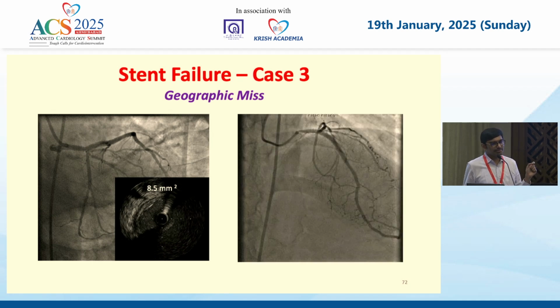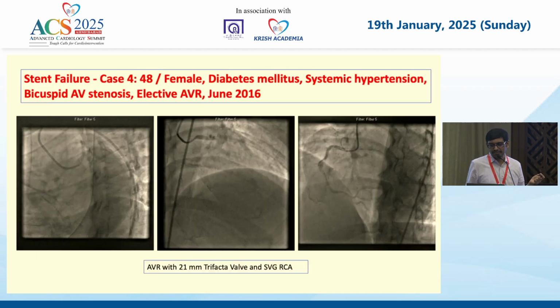2 months, you see that patient came back with a tight stenosis at the ostium. So the lesson learned in this patient is when your left main lumen is not very big in size, better to cover up to the ostium rather than just to leave the ostium uncovered.